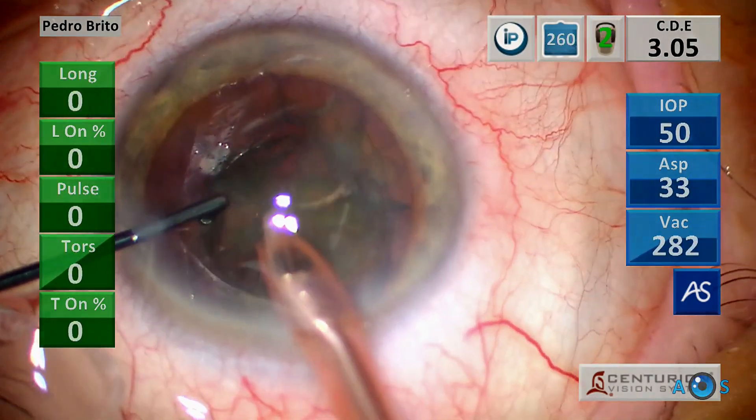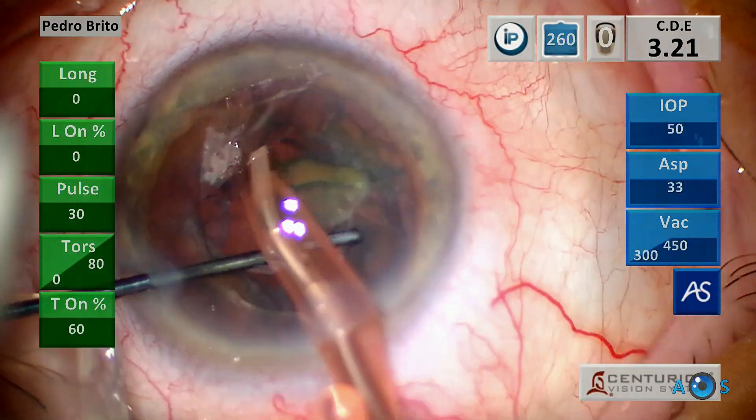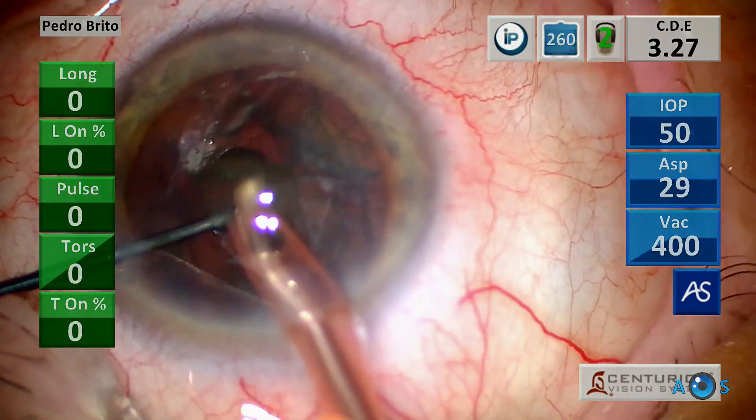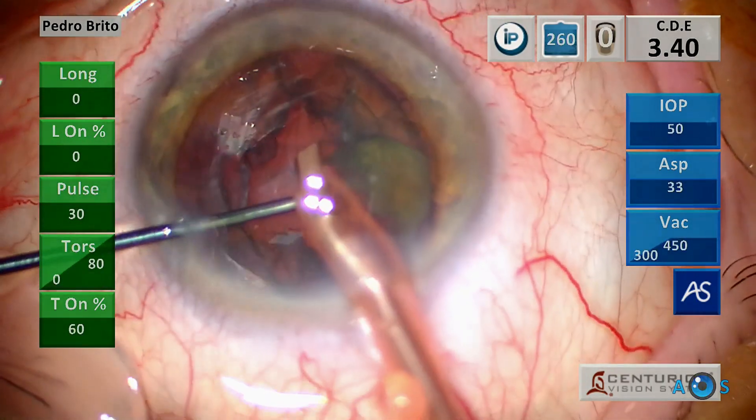Notice how the cumulative dissipated energy, an indicator of overall ultrasound energy used, raises only slightly with each successive quadrant being emulsified, indicating that the energy delivered is highly optimized.